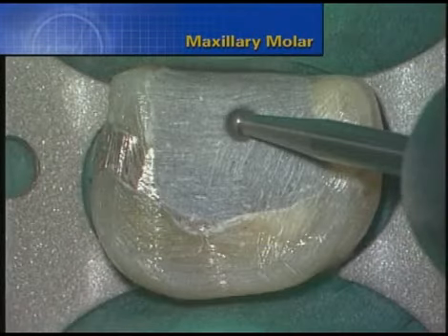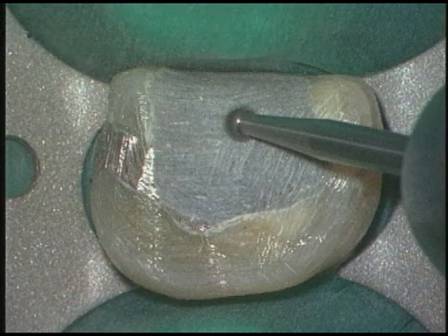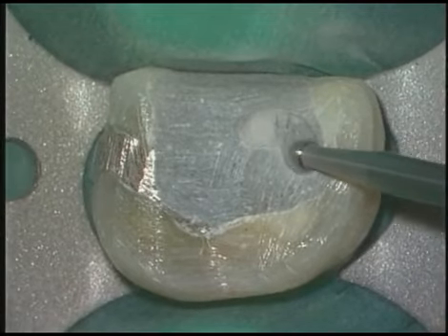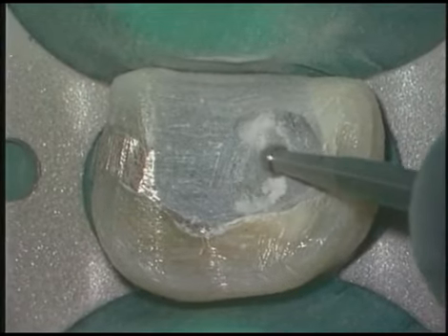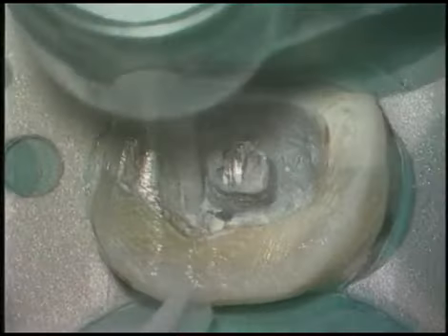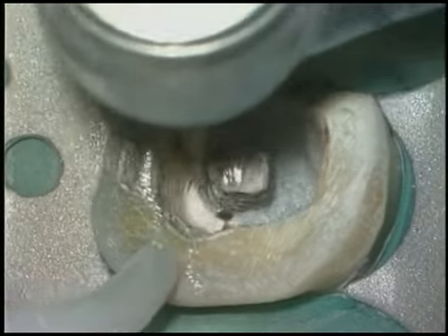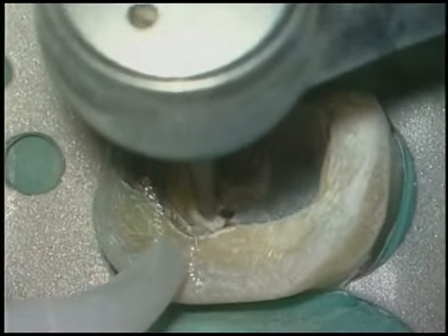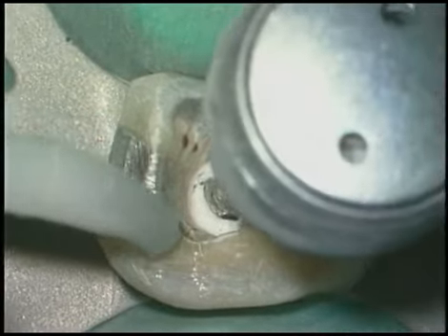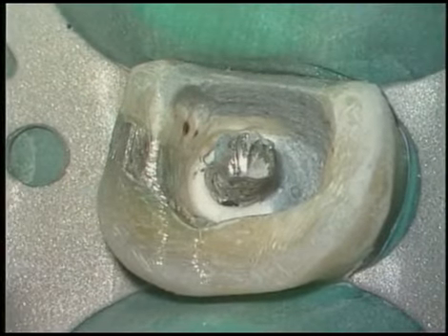This is an occlusal view of a maxillary molar. Radiographs revealed a large threaded post extending deep into the palatal canal. A surgical length carbide round burr throws the head of the handpiece further away from the occlusal table and allows for the safe removal of a brick hard composite material. Tapered diamonds are used to true up your axial walls, and surgical length round burrs and tapered diamonds are utilized to remove the bulk of restorative material from the pulp chambers.